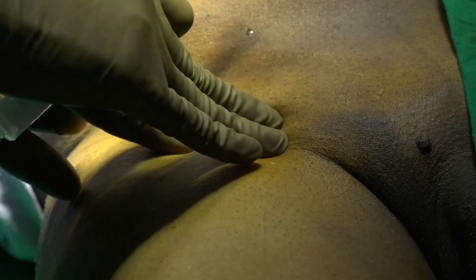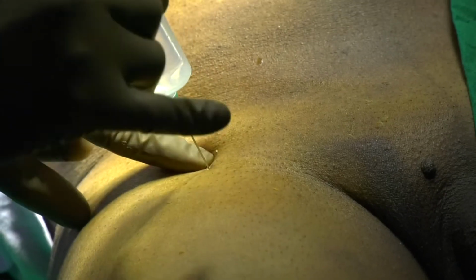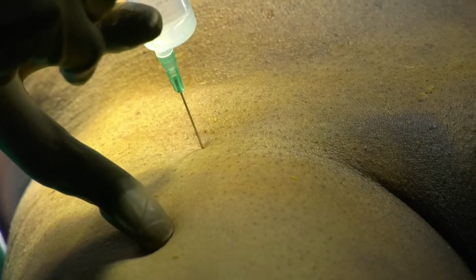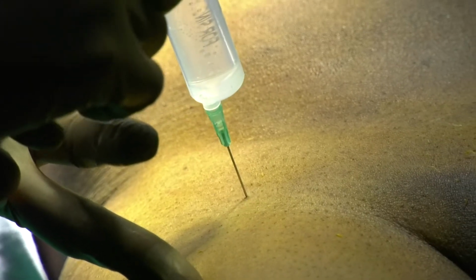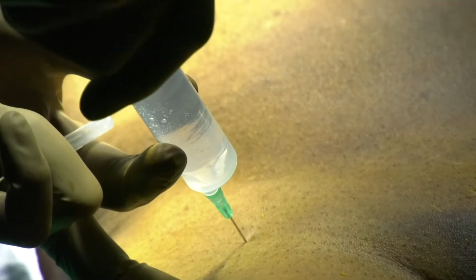For safety, palpate whether the femoral artery is there. At times it can be a little bit displaced. So the femoral artery is way aside. This is the first resistance. Can you see? This is the first pop. I have passed. And then this is the second. That's done.